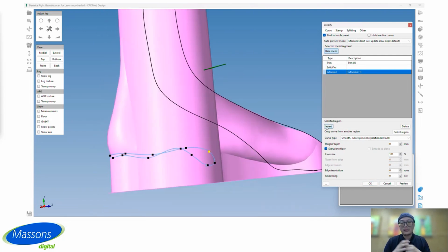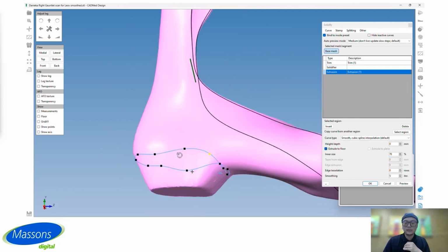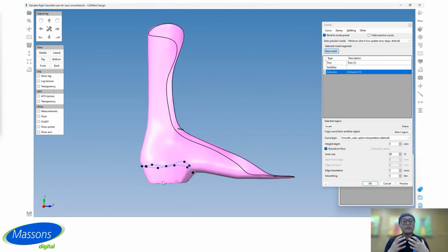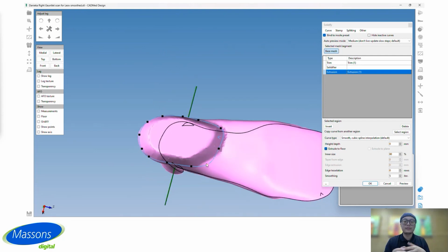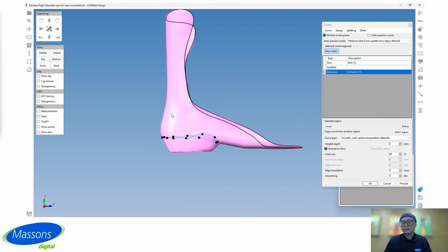You can see the trim line divided into two parts. You just need to click the invert button to select the right area and smooth it to the desired level we want. Yeah, fast and easy. Even after you've finished the design of the extrusion, you can still do it in a similar way, just like what we did with the trim line. Just drag the control point and it's easy to change the shape of the stabilizer as well.